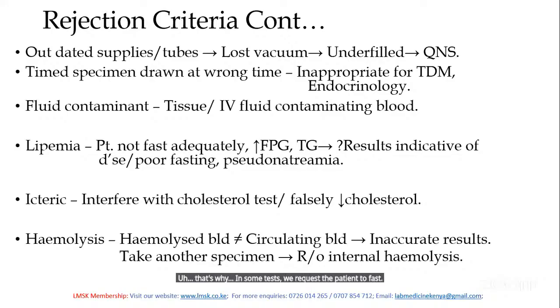Fasting ideally is to burn the fats, reduce the fats, so that we get the recommended results. So if the patient has not fasted adequately, then there are tendencies of having lipemic samples. Or if you've drawn blood immediately after the patient has taken a meal, it will be lipemic.